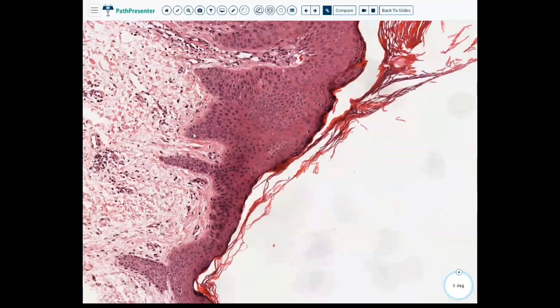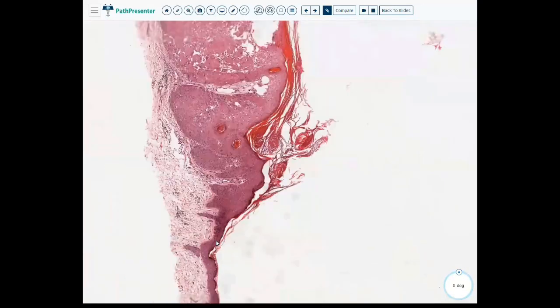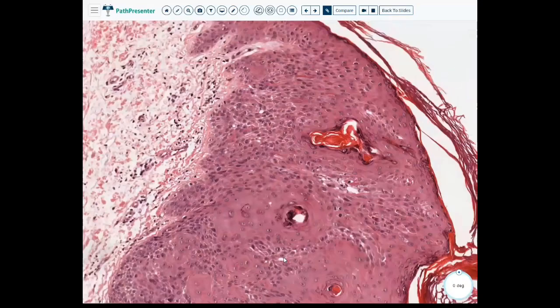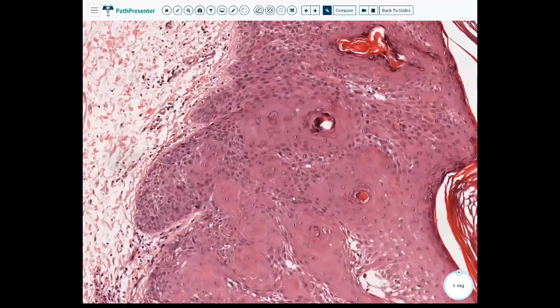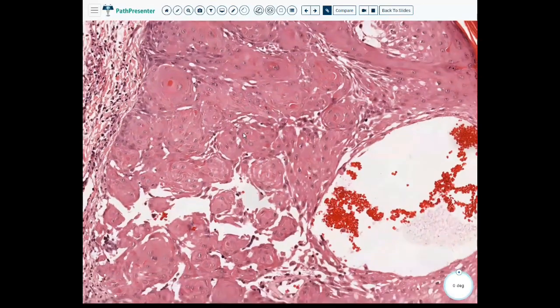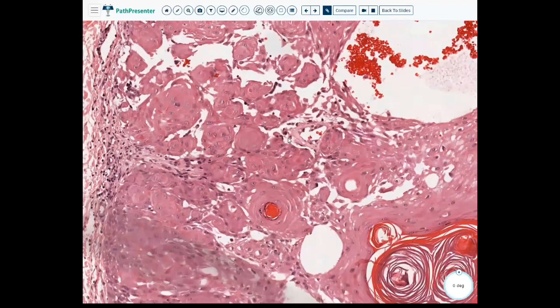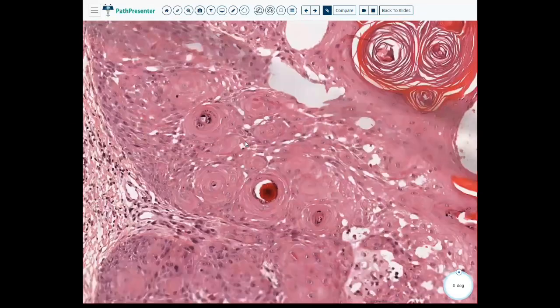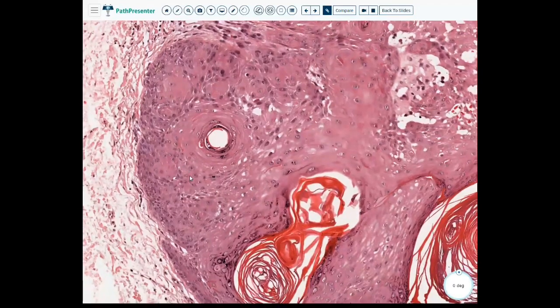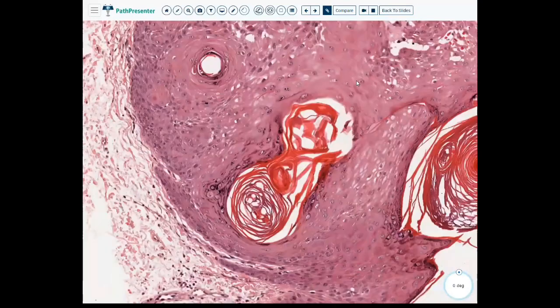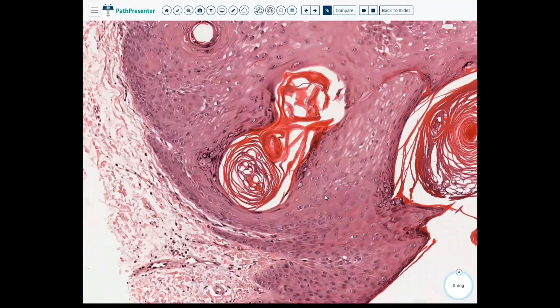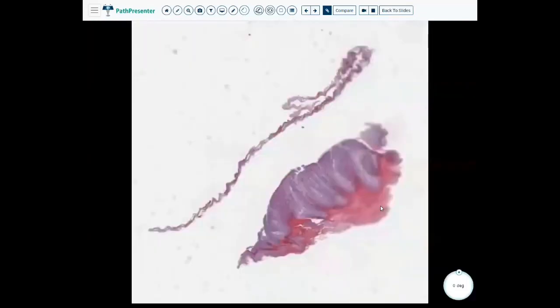Our basal layer is intact. Even though the squamous cells look a little funny, they have more of a reactive appearance — the chromatin is a little more vesicular, the nuclear membranes are still round. We do have some nucleoli and pseudohorn cysts. So this is another example of seborrheic keratosis.